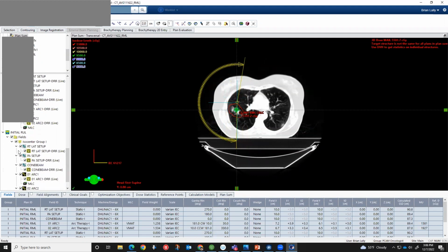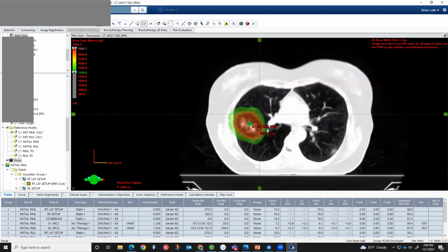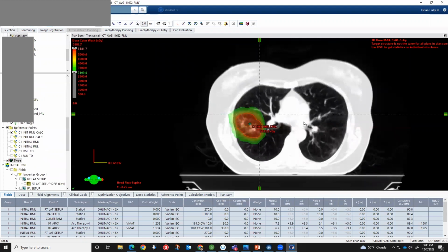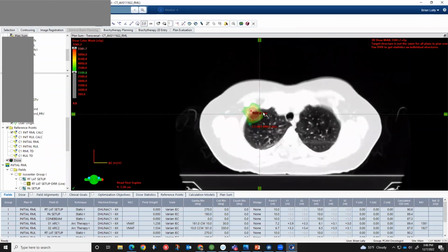What I want to be able to do is show you the dose distribution. In this patient, we're going to be treating both at the same time. And I like looking at it in color wash because there you get a better sense of what we're trying to accomplish. As you can see here, the dose falls off very rapidly. We got good coverage, and then it falls off quickly so that a lot of the other structures in the body are spared for both lesions.